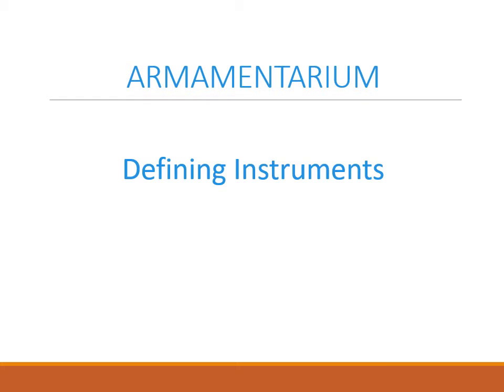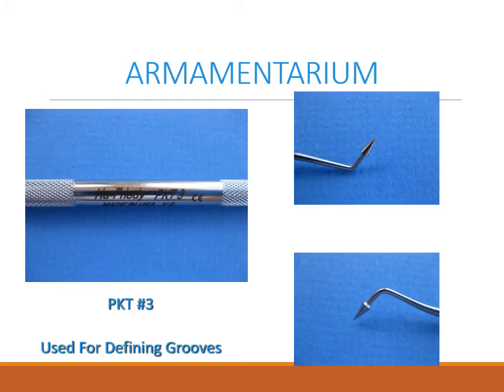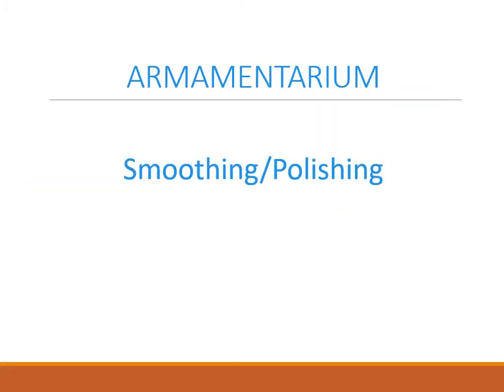Next, we have defining instruments. Here's a PKT number 3, and you can see that this one has a cone-like tip. So with a little bit of heat, this instrument may also be used for defining grooves. Next, we will talk about how to smooth and polish your wax-ups.